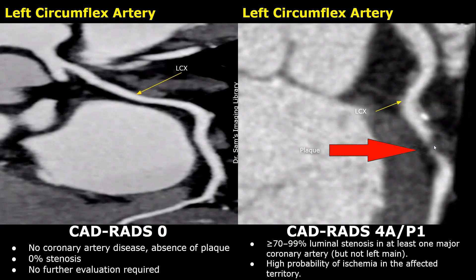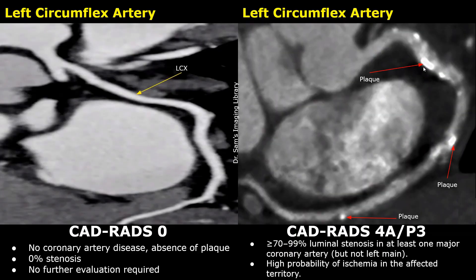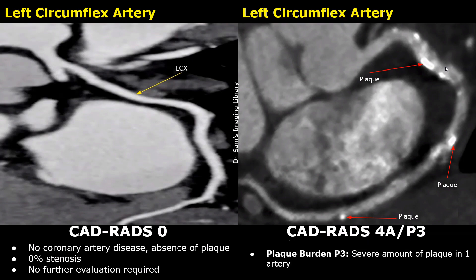This is a CADRADS-4A coronary artery disease. The maximum stenosis seems to be between 70% and 99%. Due to the presence of a severe amount of plaque in a single artery, the plaque burden is P3. If you find many plaques in only one artery and other arteries are normal, you can classify it as P3. So this case is CADRADS-4 P3.